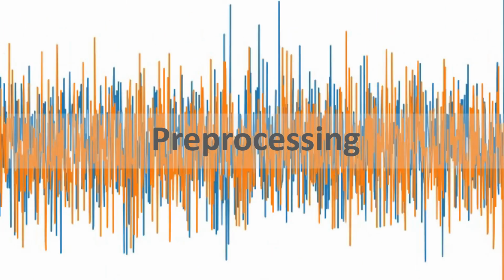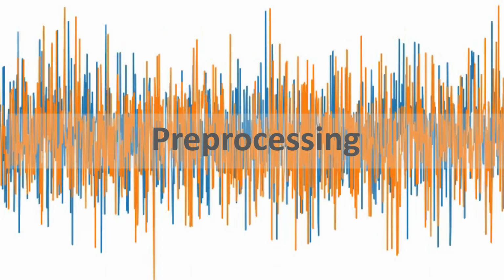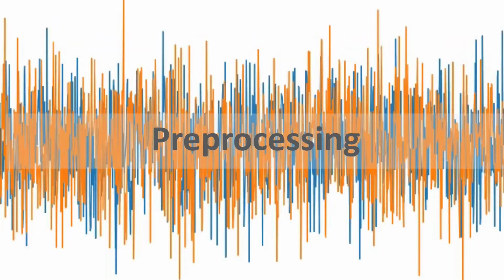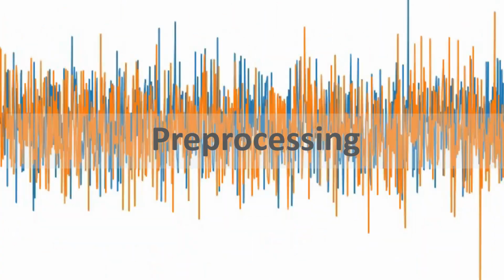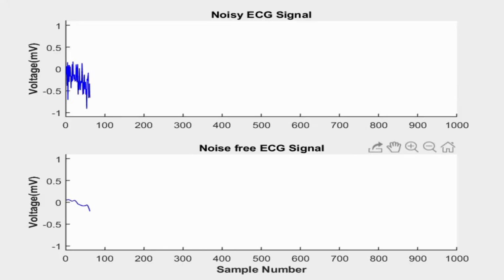These artifacts create the major hurdle in the detection process. So, there is a need to remove these artifacts before detection using different filters. In our case, 2 artifacts accompanying the ECG signal are removed one by one.